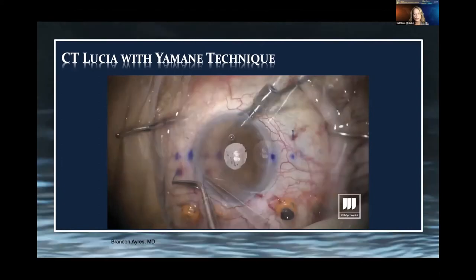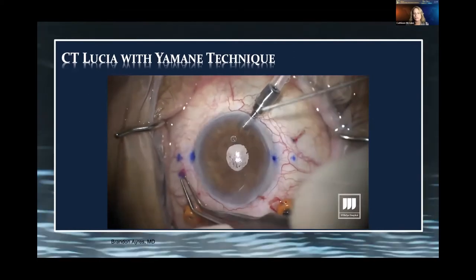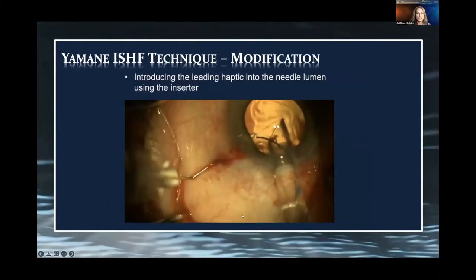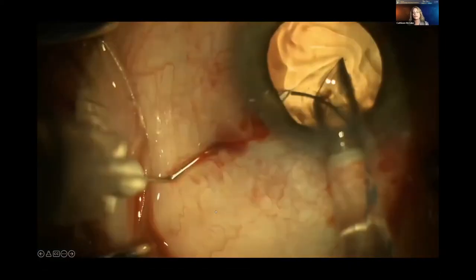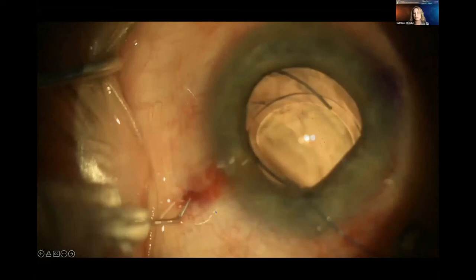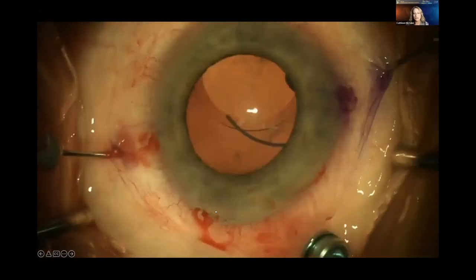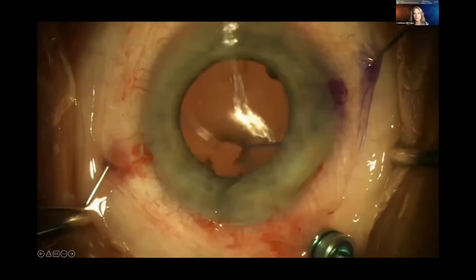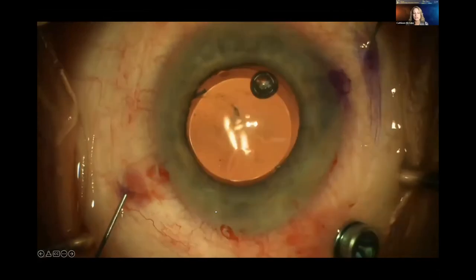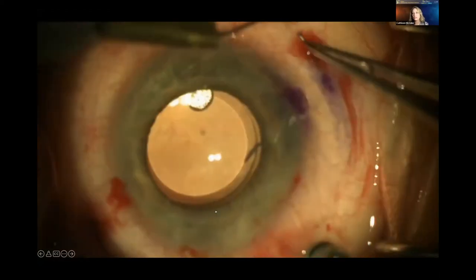These can be trimmed a little if needed for good centration. Really didn't need many large conjunctival incisions, and no large incision to get the lens in either — the case proceeds very routinely. My small modification: I like putting in the leading haptic using the inserter — it's a little more stable in my hands. I have my assistant advance the plunger slowly, then get it all the way into the needle bevel using intraocular graspers. The trailing haptic is always a bit more tricky, but once it's in the needle, I like to externalize them simultaneously, though you can do them sequentially. The bigger thing is to not externalize the first haptic — it's easier to maneuver the trailing haptic if the first is still docked within the needle.